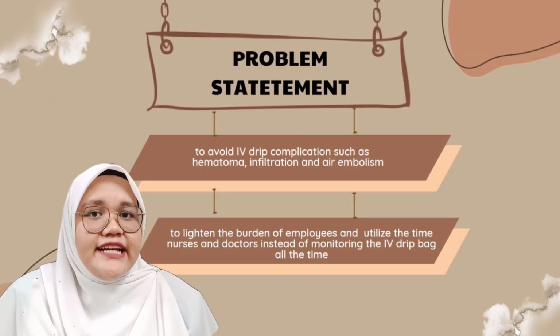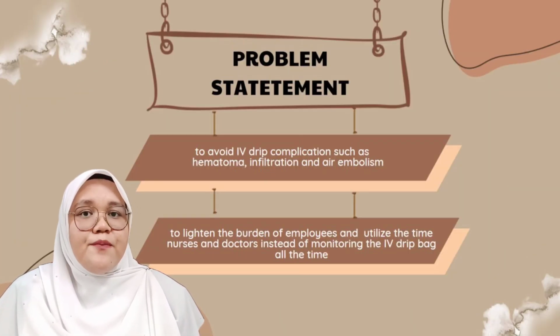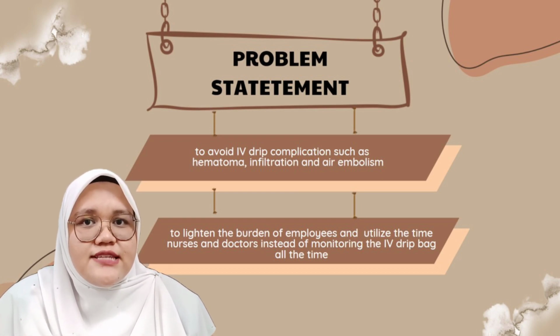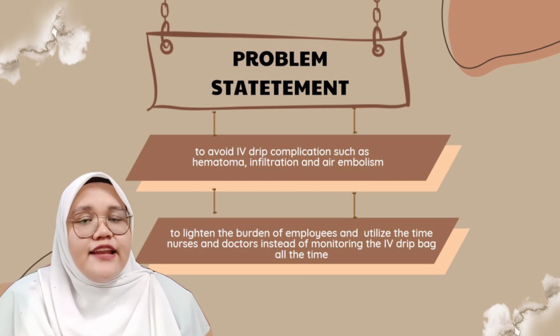Our problem statement came along with our goal, which is to make employees change the IV drip bag on time to avoid IV drip complications such as hematoma, infiltration, and air embolism.